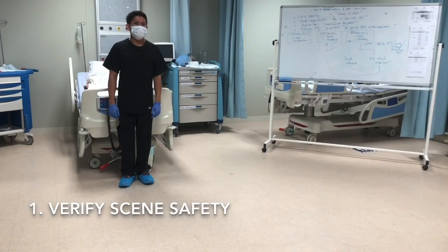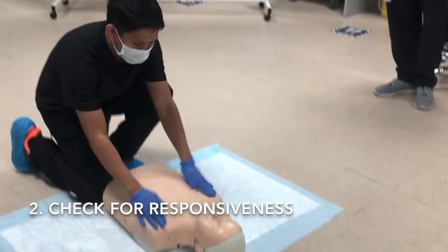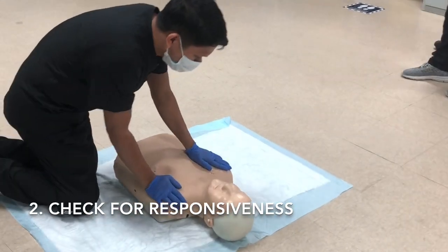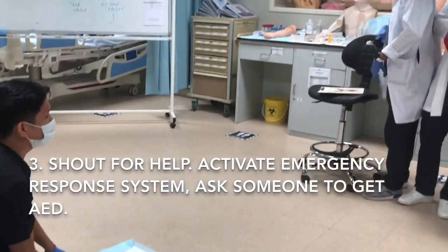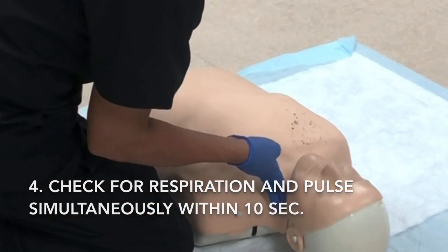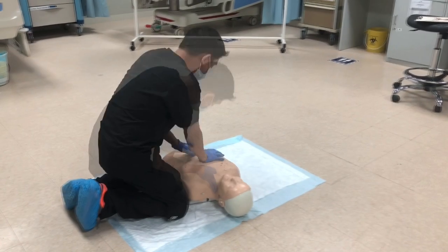Scene is safe — I have one victim. Hey sir, are you okay? Call 997 and get an AED. Checking for pulse and respiration — no pulse, no respiration. CPR.